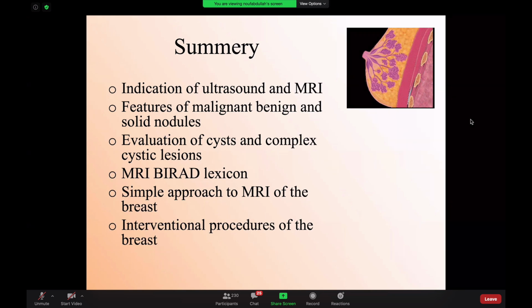Okay. Dr. Yasser is asking, can we BI-RADS each breast differently? That's what I usually advise, because sometimes the BI-RADS is benign on one side and malignant on the other side. So I give a BI-RADS for the right and a BI-RADS for the left. Okay, so many questions. Dr. Abdelmalik is asking, is there any difference between malignant features on ultrasound between males and females? It is the same for both.